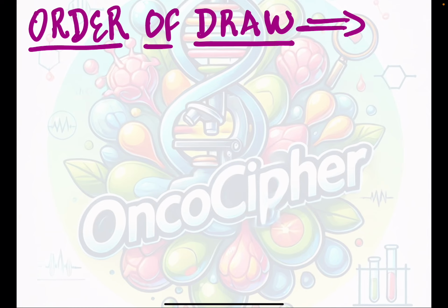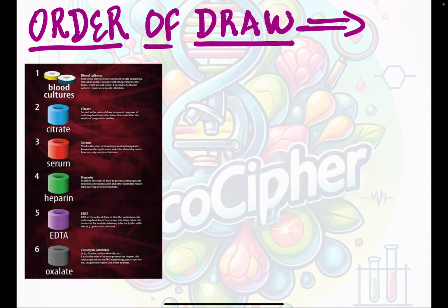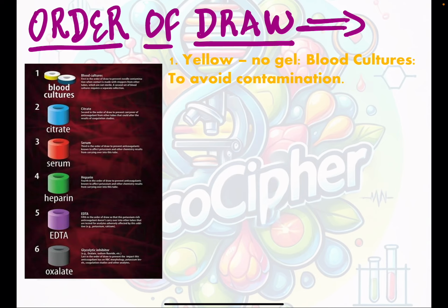Now, the next most important thing that we should know is the order of the blood drawn in each of these bulbs. You cannot randomly put it in any color. So, there is a specific order. The first one that should be filled is the yellow one with no gel that is used for blood cultures to avoid any contamination as we are checking for bacteria, etc.